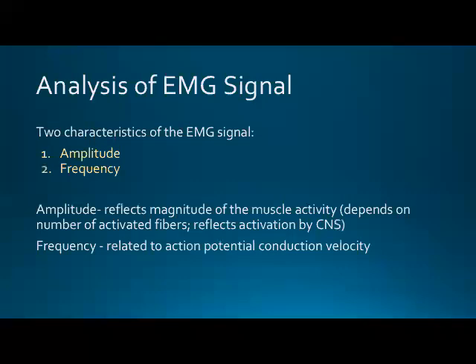And that's what we're going to try to use our EMG and MMG to determine, which one of those is occurring. So if you're using EMG alone and you're looking at the amplitude, you can't differentiate between whether you're recruiting more fibers or recruiting those fibers more often. You have to combine those together because it's just looking at overall activation of the central nervous system, not the specific strategy of activation. So this is definitely a flaw of using EMG alone. If only EMG is used, you could say, yes, activation went up, so central nervous system or neural drive seems to go up, but you can't say why that occurred.